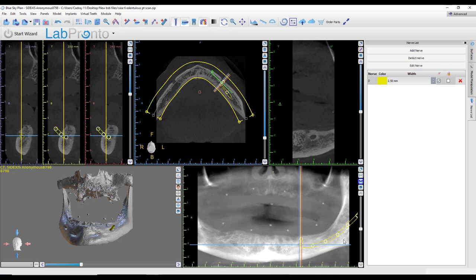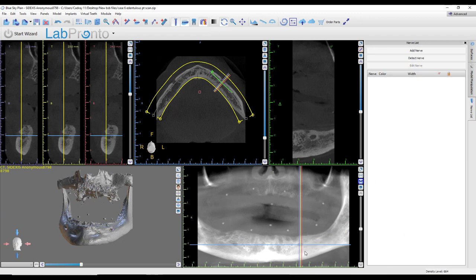When it's not locked, you'll notice these nodes are apparent. If I grab any of those nodes, that allows me to manually reposition. So if I didn't like something about how the nerve mapped, I could manually reposition that. Let's delete that nerve and instead do this case the manual way.